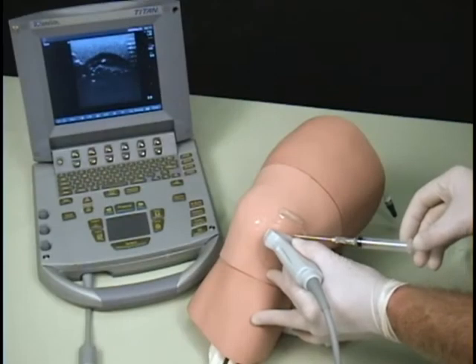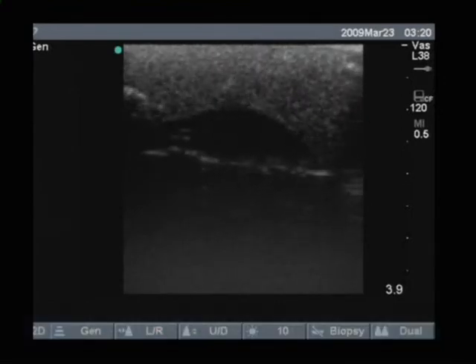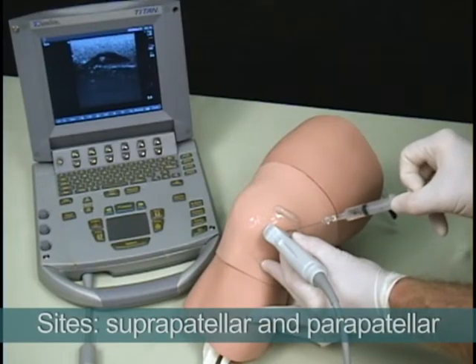Simulated synovial fluid can be removed from a joint cavity using either the medial or lateral approach. The model's insertion sites include suprapatellar and parapatellar.